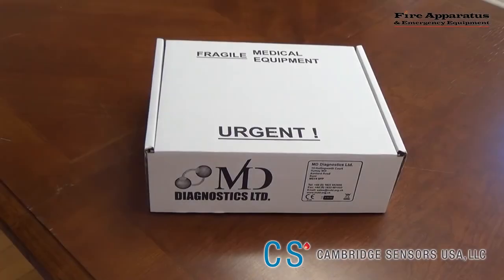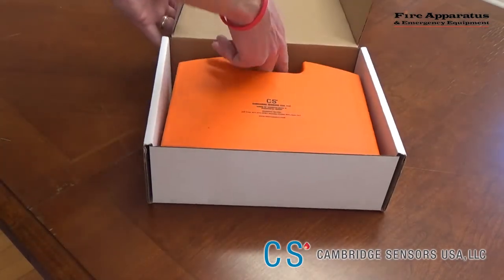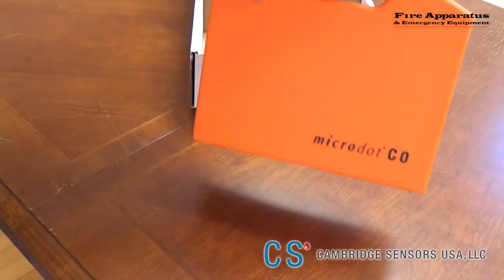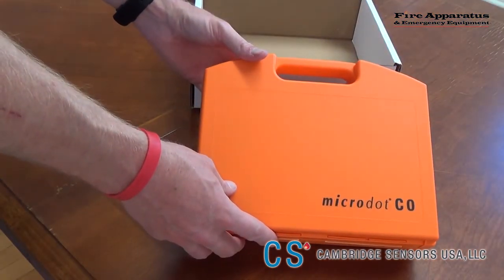So let's get down to it and take a look at what Cambridge Sensors USA sent us. When you receive your Micro.CO breath analyzer, it will come in this white box. Once you open the box, you'll find the orange briefcase and everything you need to get started is right here.